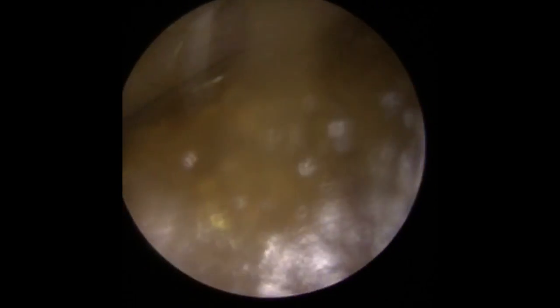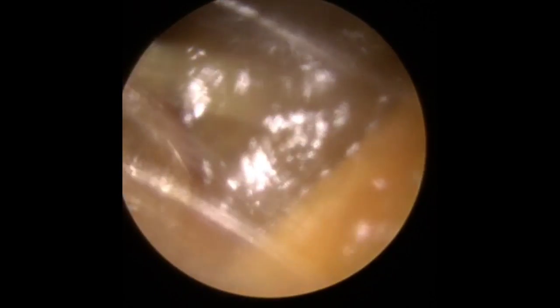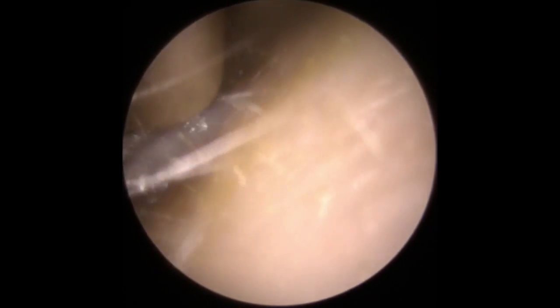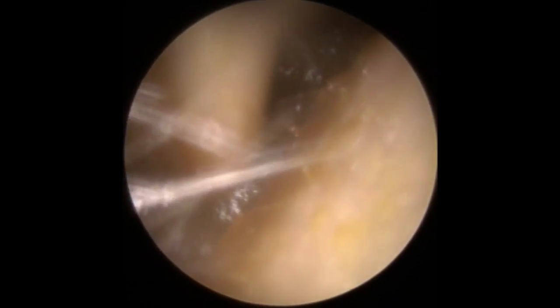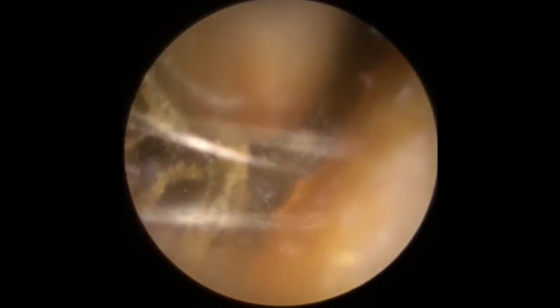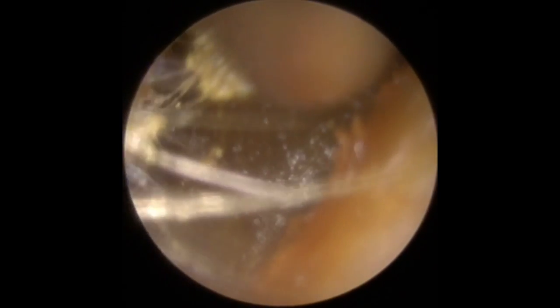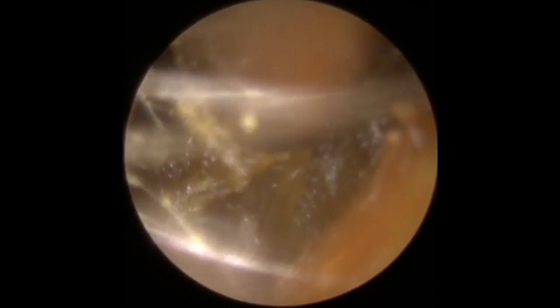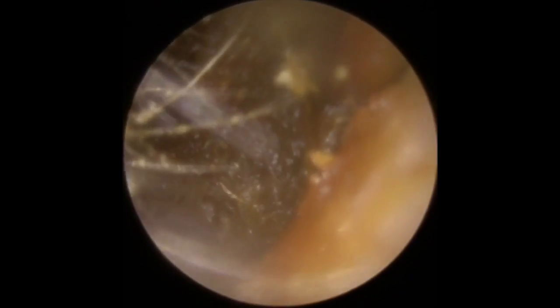Now, a very different patient came through on the same day. It just goes to show you just never know what's going to walk through the door. You get one patient with extremely dry, hardened-up earwax, and the next patient has very, very soft and sticky wax — very different removals. You can see that we have to approach things a very different way. So for this person, there's no point in going in with a Jobson horn at the moment — it's just going to make a big mess in this ear canal. The wax is going to end up everywhere it shouldn't be, stuck all over the canal walls, which is going to be really uncomfortable to remove for the patient. So we're going to go straight in with the standard size Zolnir tube for suction.